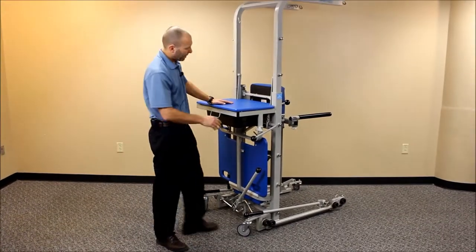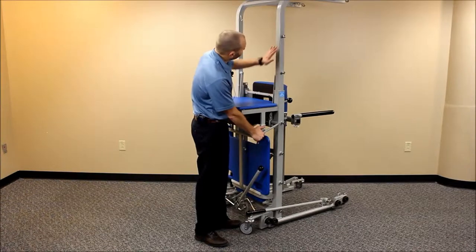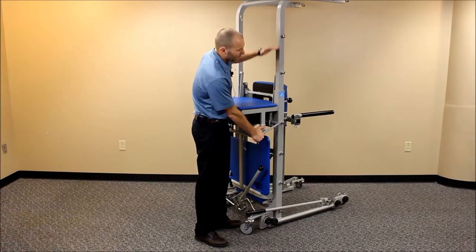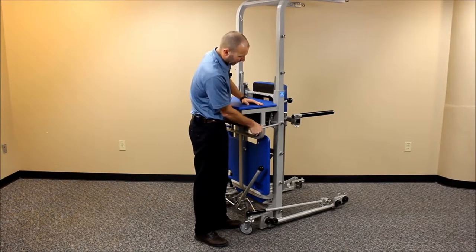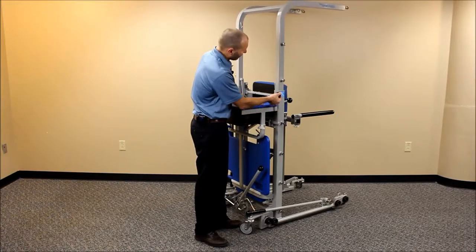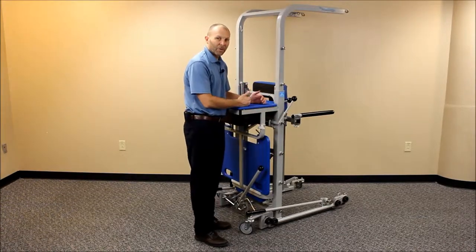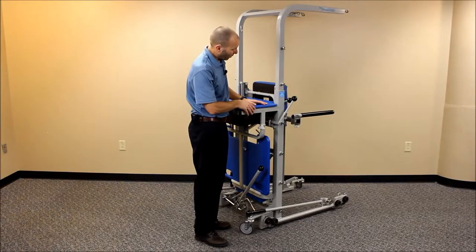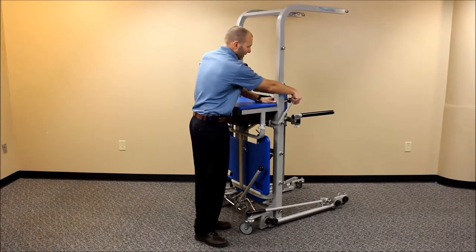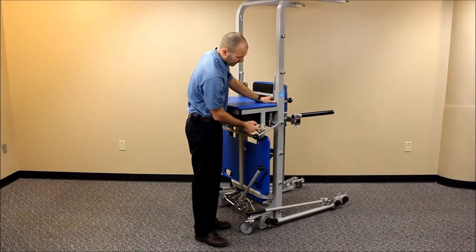Another feature to be aware of is a lever on the side of the unit for raising and lowering the upper support piece by several inches. If I move this locking gate out of the way, I can flip this up and lower that down about six inches. This is great for getting through doorways or if you have trouble reaching the tops to hook accessories or harnesses to. To extend it again, just pull down until it clicks past the locking gate.